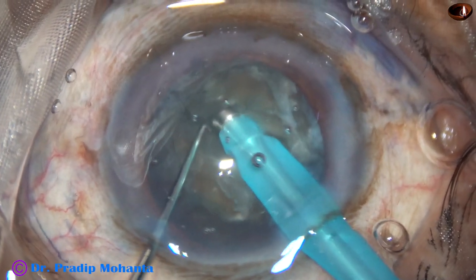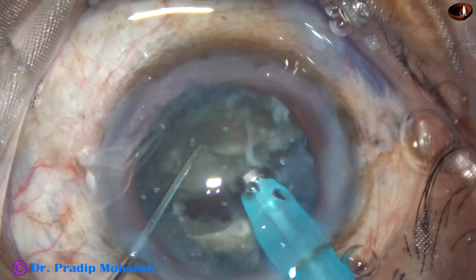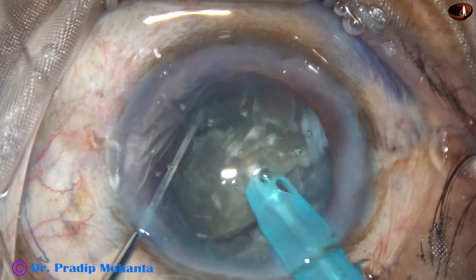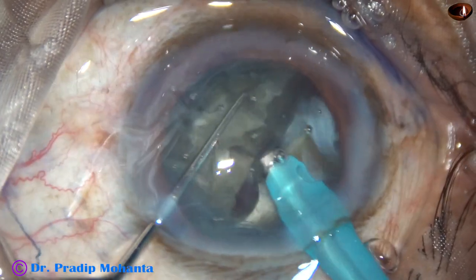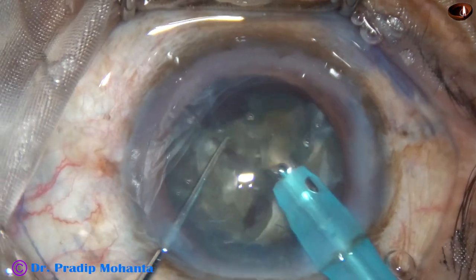The nucleus is rotated 180 degrees, and then the nucleus gets completely separated into two halves. This is one hemi-nucleus divided into two fragments. Each fragment is then emulsified.